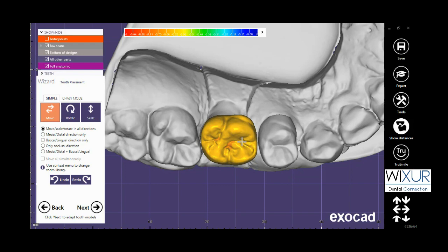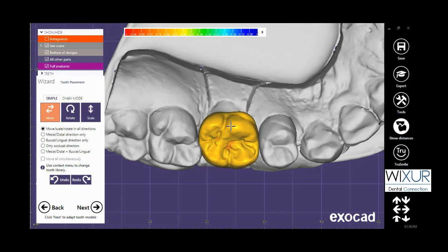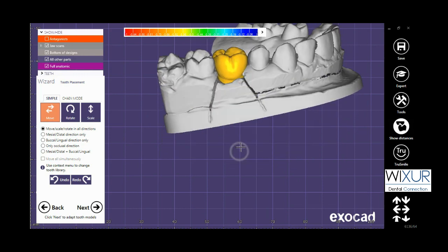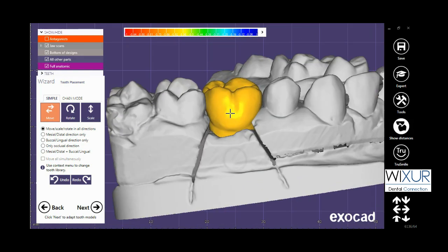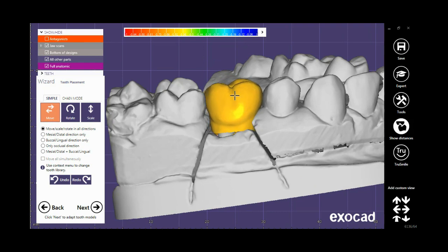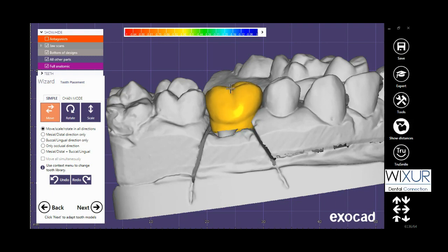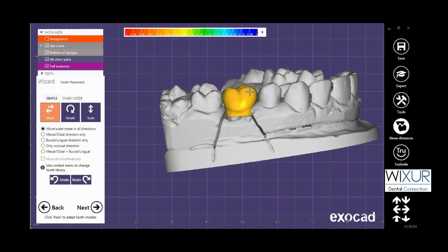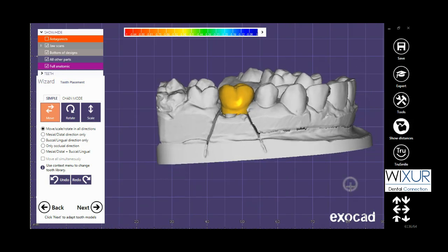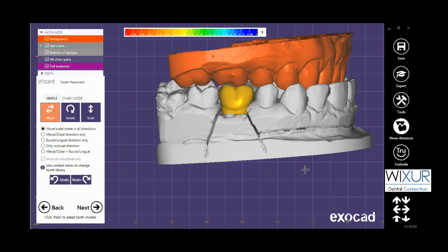You can also scale in only one direction — mesial/distal or buccal/lingual — by holding both Shift and Ctrl on the keyboard and left mouse click. It is also possible to do it in occlusal direction, or in any other direction, by holding both Ctrl and Shift on the keyboard.